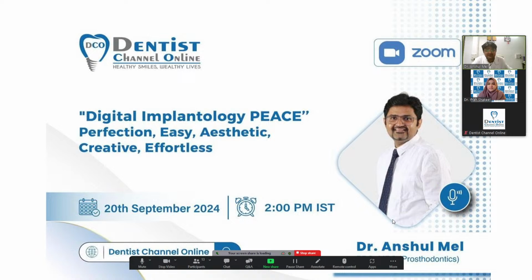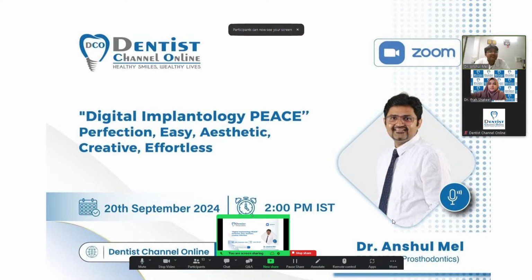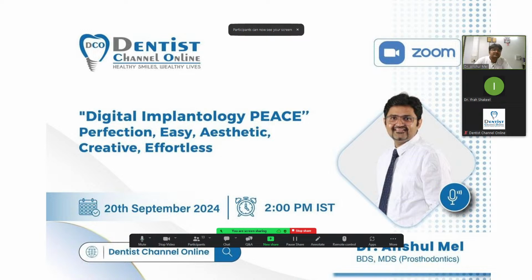Today I'm going to share, as a prosthodontist and implantologist, how the digital era helps us solve problems from implant placement to the end of the prosthetic. For the patient, it is only the prosthetic. They are not going to see how you placed the implant.